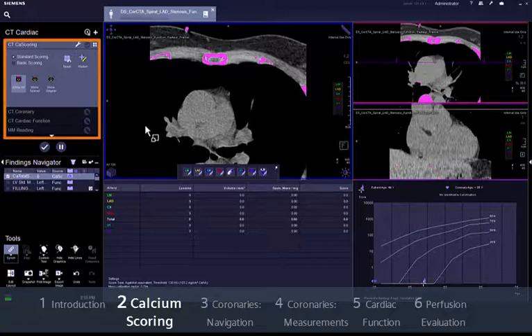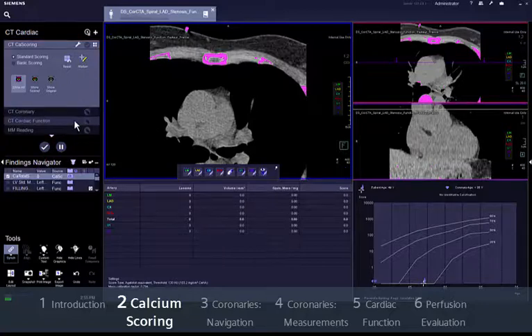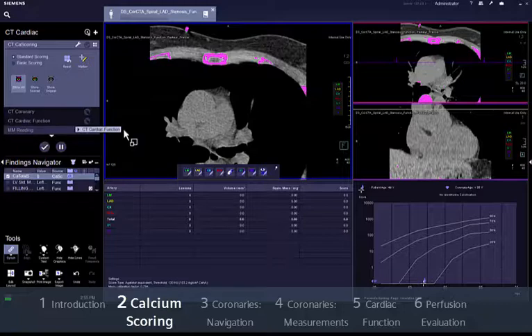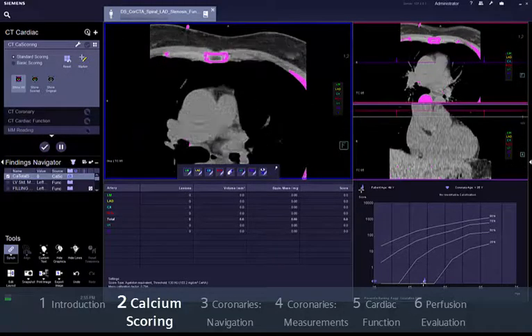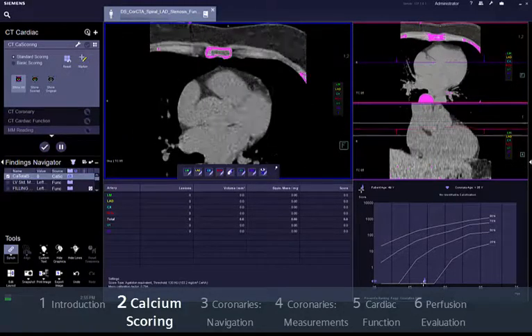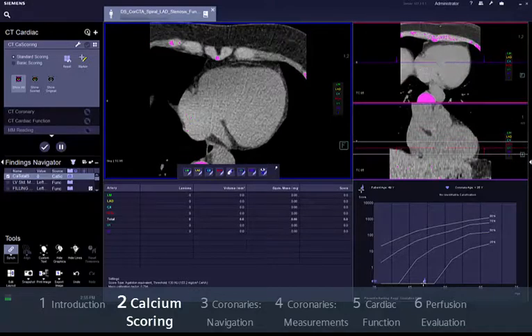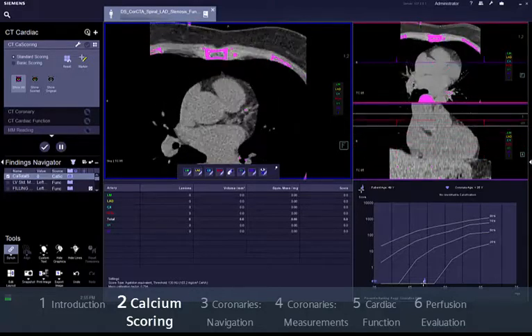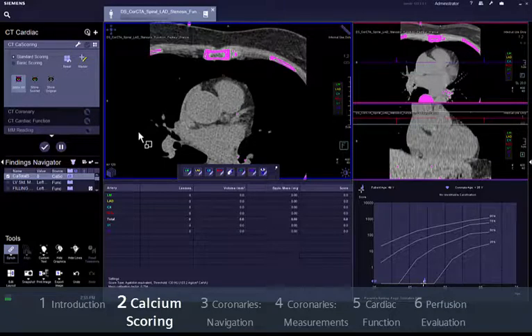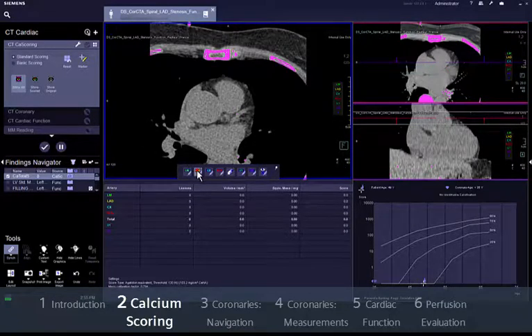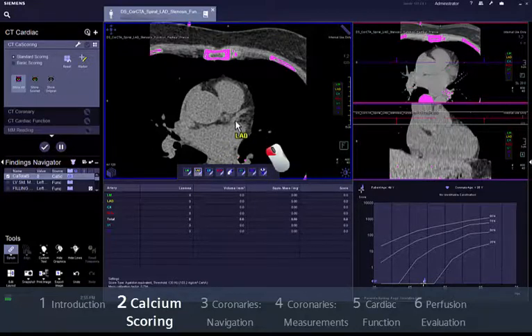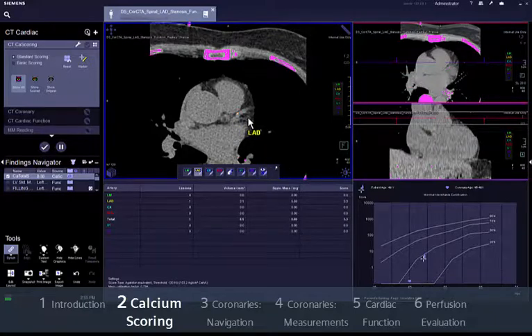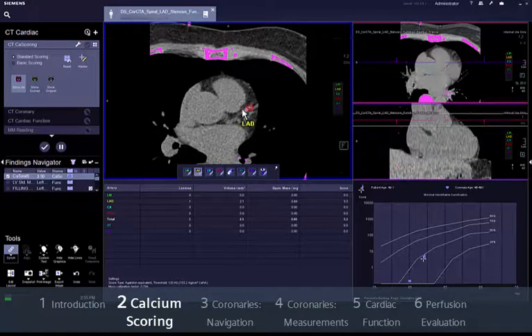Assessment of coronary artery calcium burden can be used as a prognostic indicator of the patient's risk of a cardiac event. CT calcium scoring allows accurate visualisation and quick quantification of calcified coronary lesions by highlighting the lesions with a pink overlay on a non-enhanced series. Scoring is easily performed for the main coronary branches by clicking or contouring around the lesions with the corresponding label.